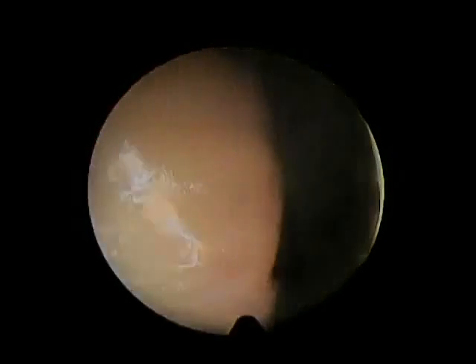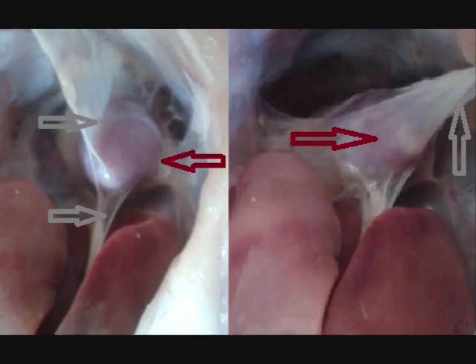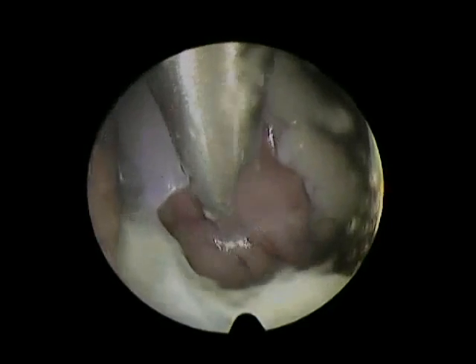This is the chicken's heart inside its pericardium. Actually, for your information, the chicken's heart is indicated by the red arrow here, and it is inside the pericardium, the gray arrow. So I kind of wanted to cut the pericardium to see the heart inside. Well, it was just an idea. You just have to be creative when you do these kind of exercises. Here, I cut the pericardium, you see, very slowly with the scissors, and I got inside it.